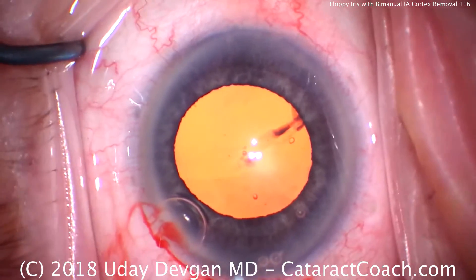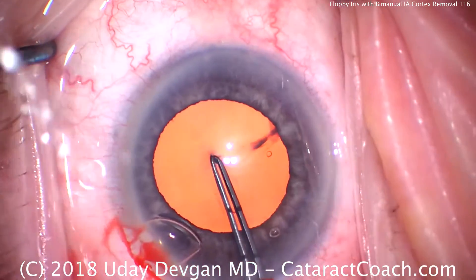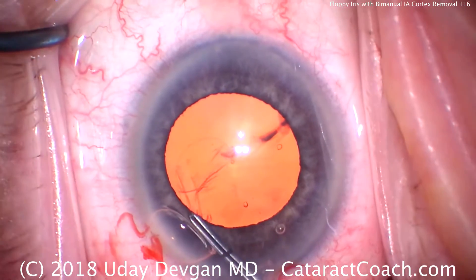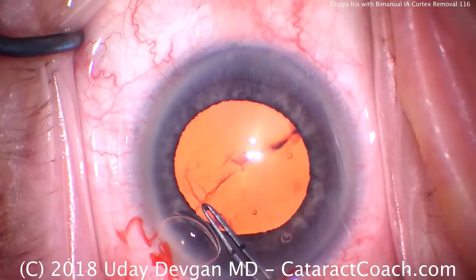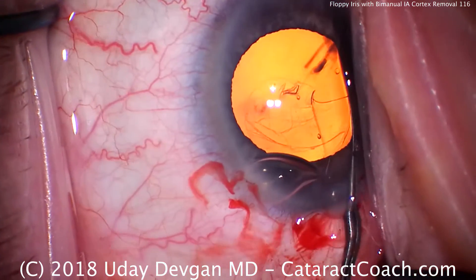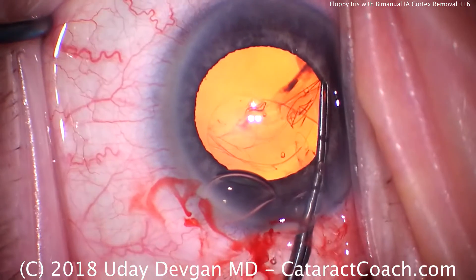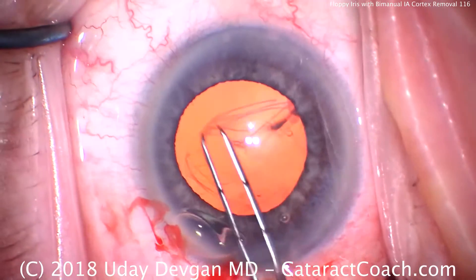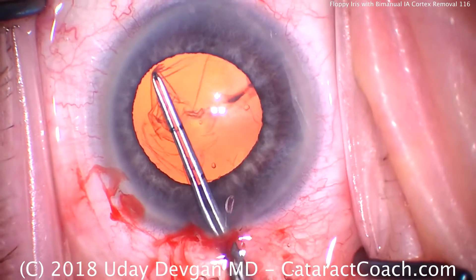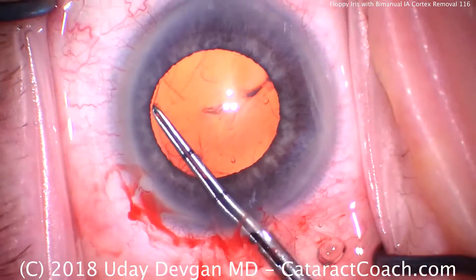This pupil dilation is maybe even six millimeters, and we want to ensure that we have at least a five and a half millimeter capsulorhexis. There's the rhexis edge — we can see we're tearing this. As we tear the rhexis, we lose a little viscoelastic out the incision, and that's going to cause the pupil to come down because it's that viscoelastic that's holding it there. I'll start to hug the edge of the pupil in creating this capsulorhexis. That looks like a pretty good rhexis, nice and complete.